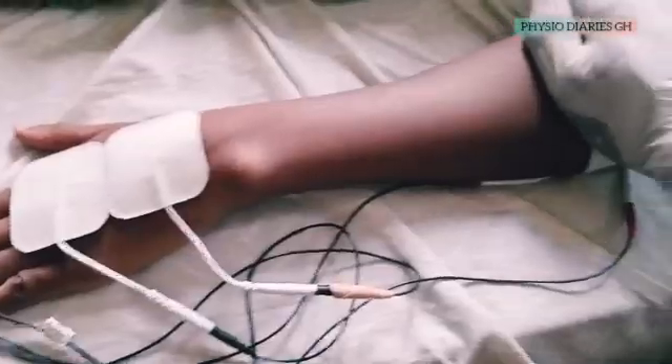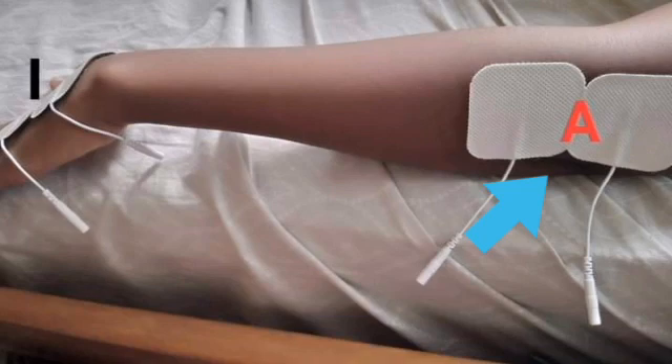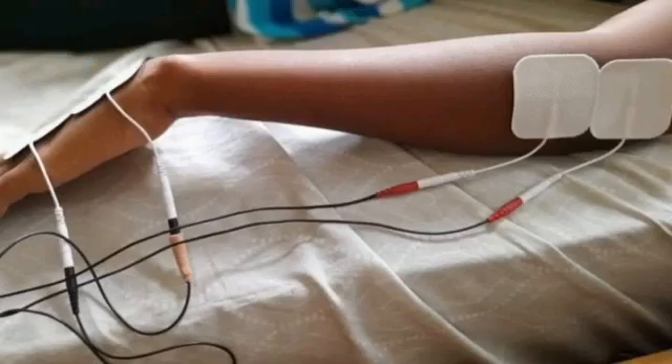For the placements: place one or two electrodes on the common wrist extensor tendon, just close to the lateral epicondyle of the elbow. Place the remaining two on the posterior parts of the hand, exactly as shown in the video. Connect all active electrodes on the epicondyle side and the inactive ones on the posterior part of the hand.